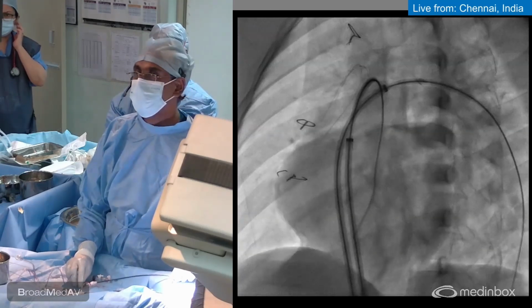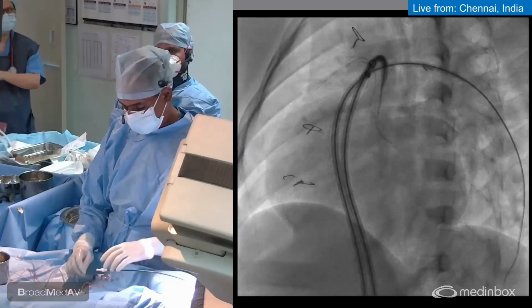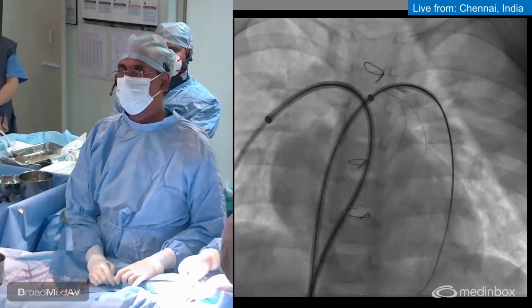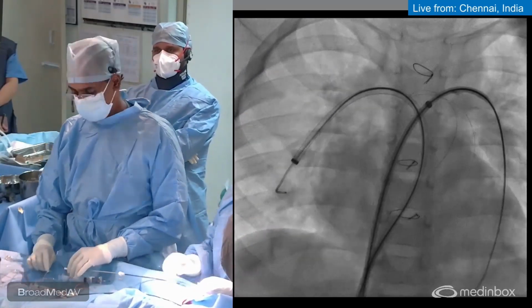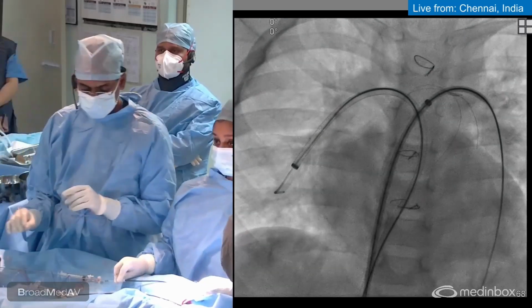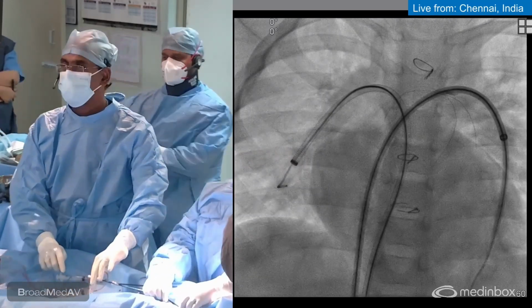Let me first get the stents deeper into the pulmonary artery. So now I'm having the right pulmonary artery stent. Sheath. Planning to advance the sheath. Now. Advance the sheath. So we've gone across the right pulmonary artery, holding the sheath. And similarly, I'll make an advance into the left pulmonary artery. Holding.